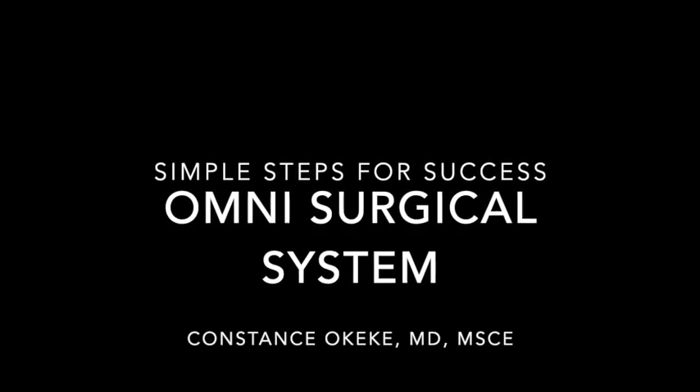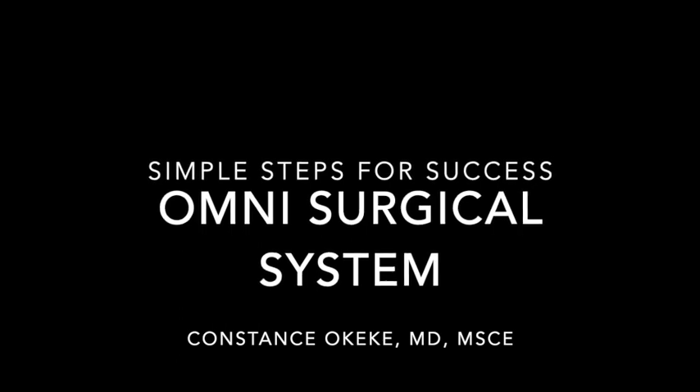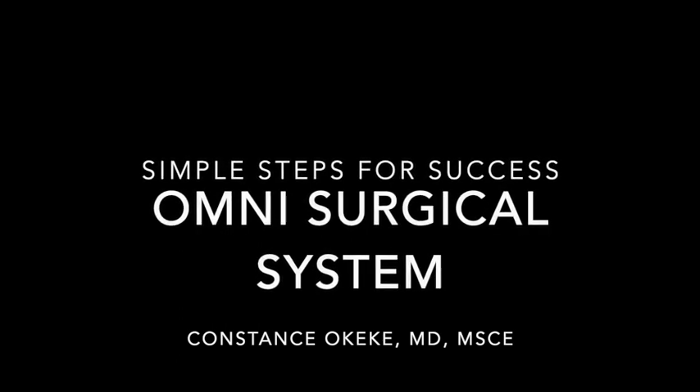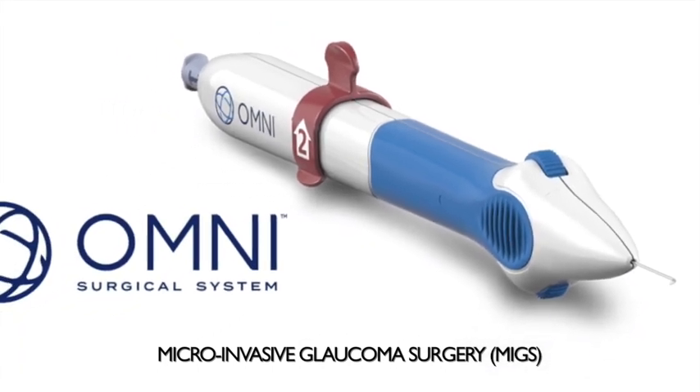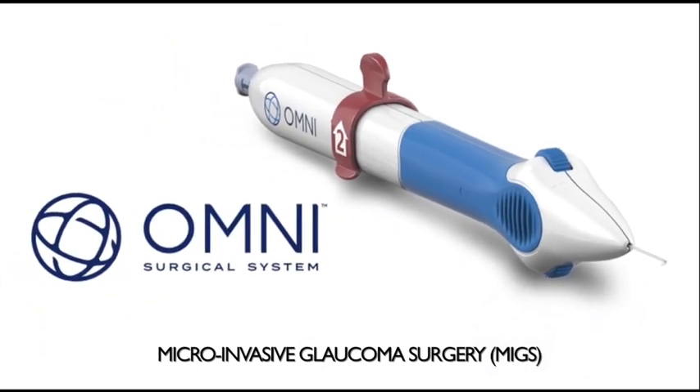iGlaucoma presents Simple Steps for Success with the Omni-Surgical System by Constance Okeke. In May of 2020, Sight Sciences launched a new handpiece for their Omni-Surgical System.